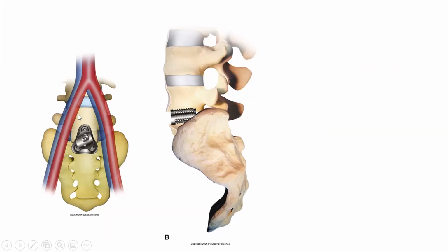They are also not a problem to move, but the vein, especially the iliac vein, there's a little vein there called the ascending lumbar vein, which goes up here. If you pull this vein across, you tear that vein, and your sucker goes very quiet, and the belly fills with blood. You lose a lot of blood very quickly, and it's a real fight. So your vascular anatomy is very important.